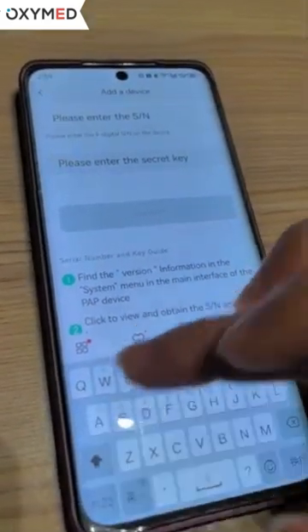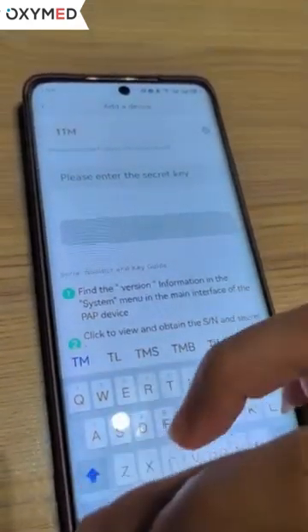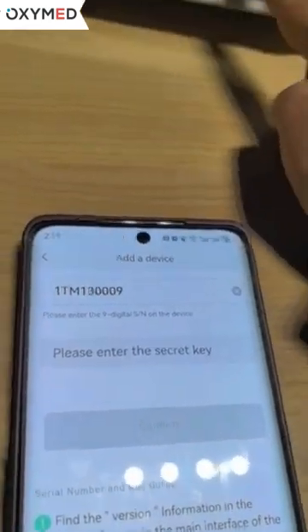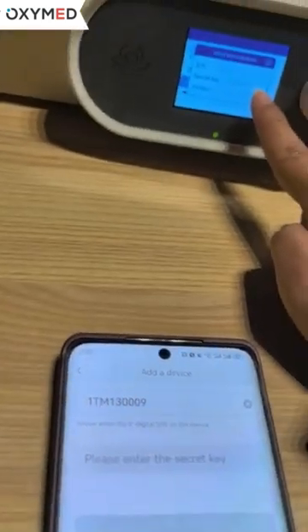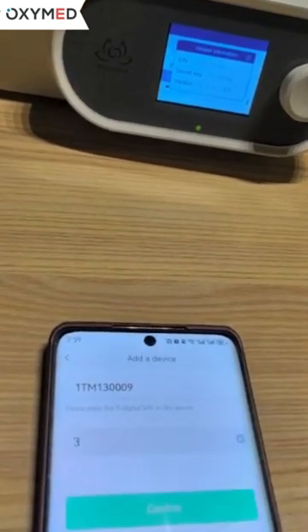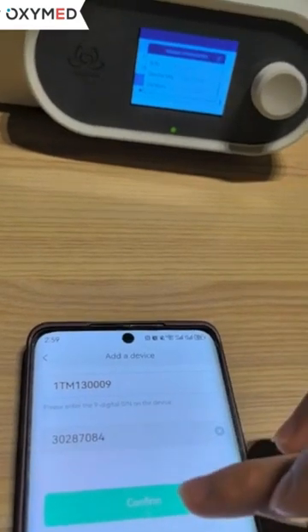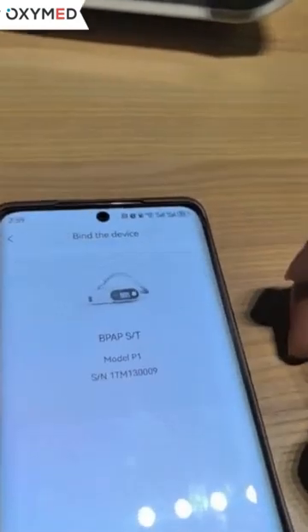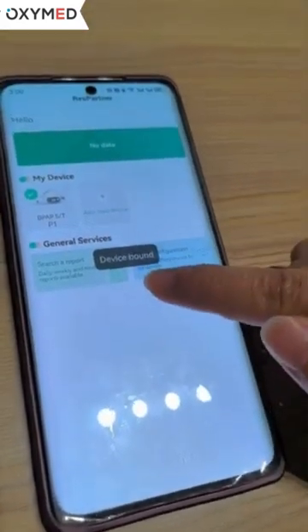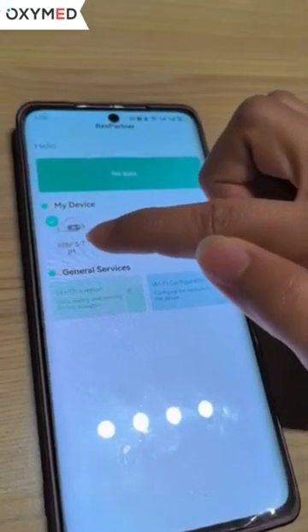Next, we return back to the Wi-Fi connect app and enter the device number — for example, this is the number of the main device. Then we enter the secret key and click confirm.